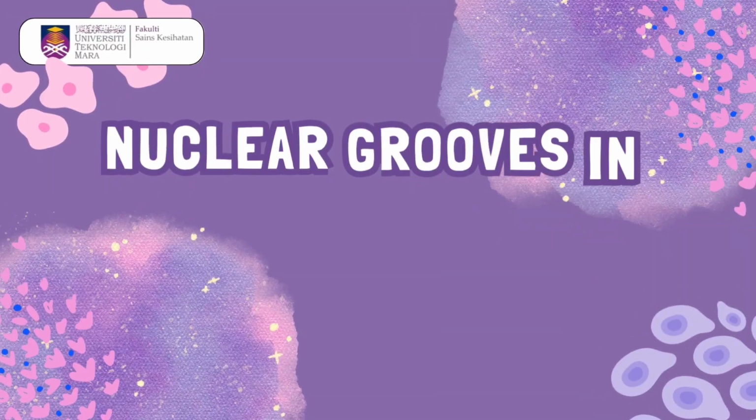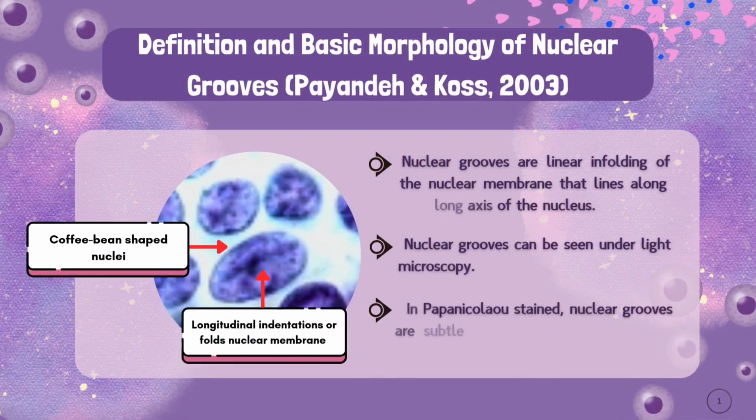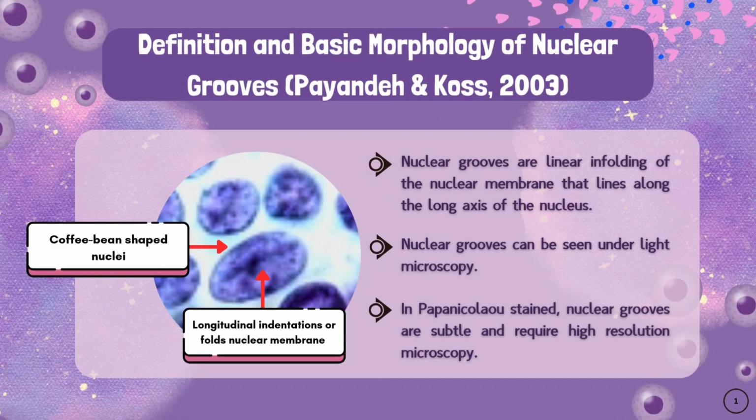Welcome everyone. In this video, we will discuss nuclear grooves in normal and abnormal cervical smears. Let's start with the introduction about what a nuclear groove is.